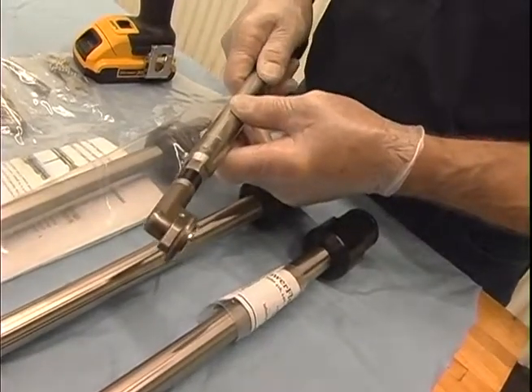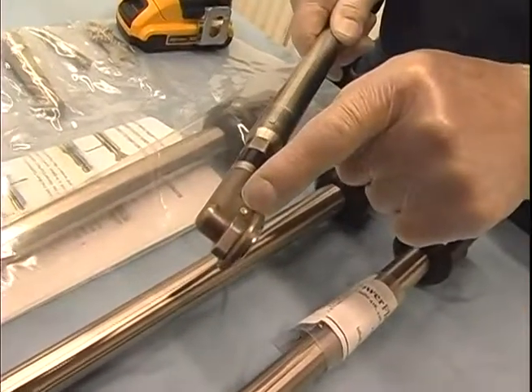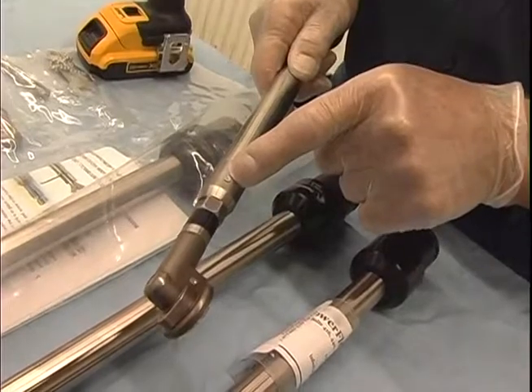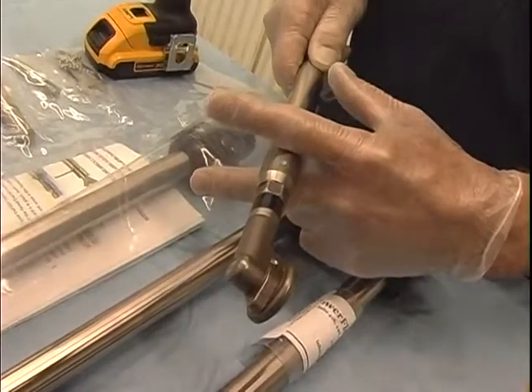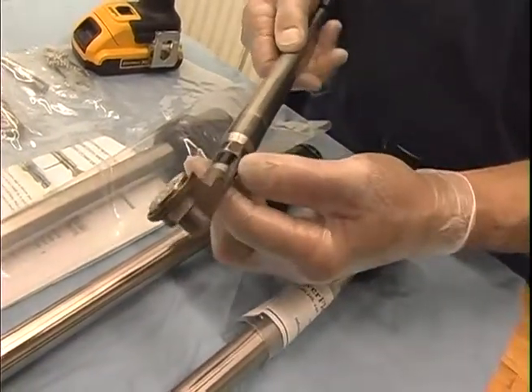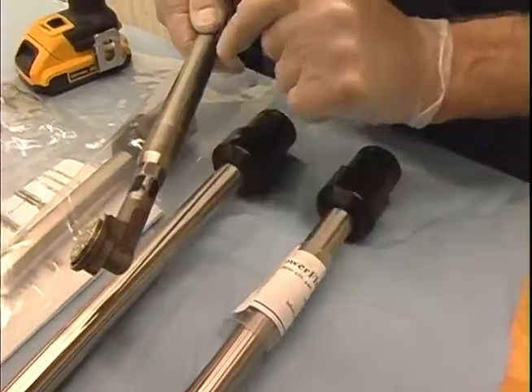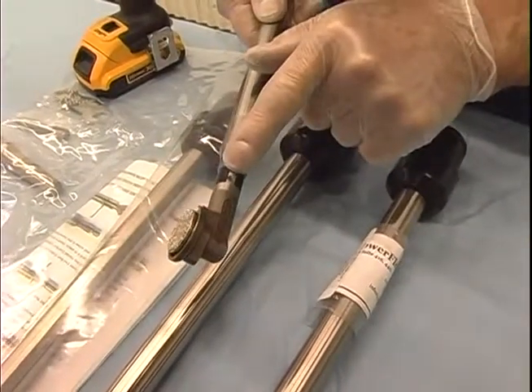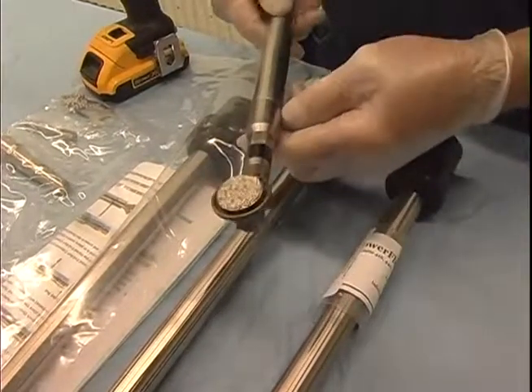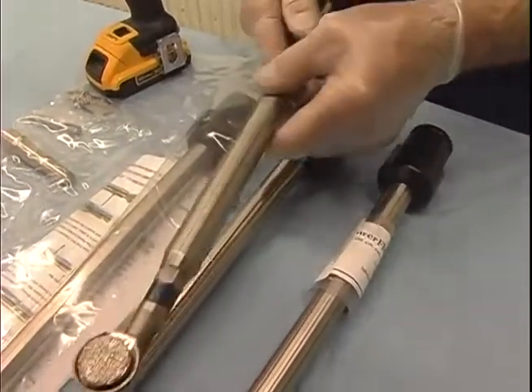All of these particular right angles have a grease port to grease the gears inside. There's a grease port sitting here. There's another grease port back on the shaft, and behind this grease port is a grease seal to prevent grease from going down the shaft. This black cover covers the opening into the shaft, which is an exit for the grease to come out when the grease procedure is being done. After greasing, the cover is rotated back over the opening. So this is the right angle shaft.